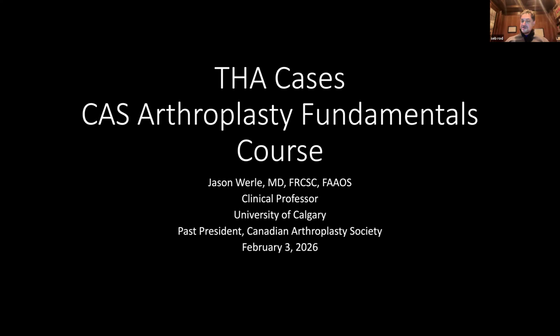There's a lot of strong evidence coming out that more kinematically aligned knees, whichever alphabet soup you want to use to describe that, generally do a bit better in terms of fewer soft tissue releases. I think we're just the tip of the iceberg, but that iceberg is immense in knee replacement, which I think is going to be hugely technology dependent to be able to reproduce. But that's, again, my opinion as a biased spokesperson of those technologies.